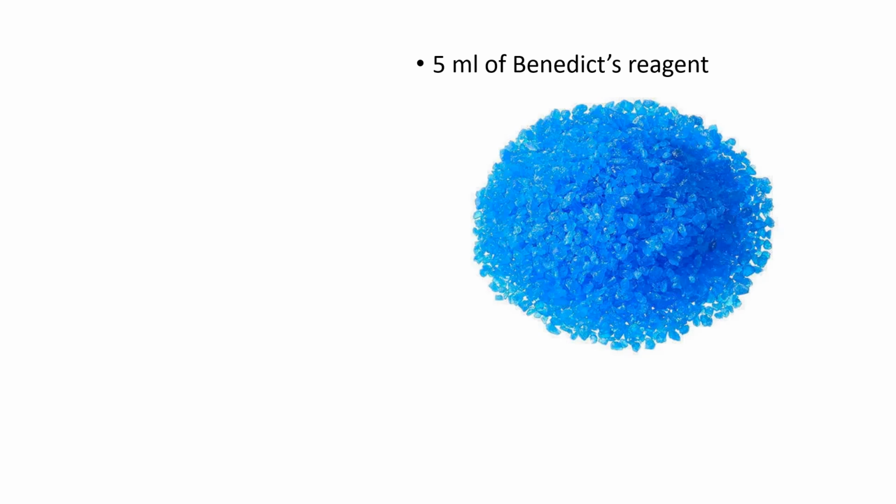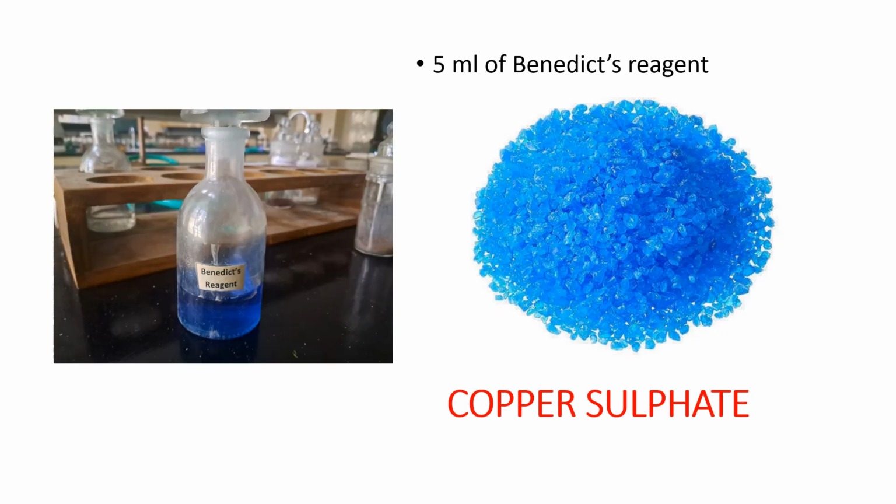It contains something called copper sulfate. So what we have is we take these very beautiful blue looking crystals and we put them into the water, and eventually we get something called the Benedict's reagent, which is an aqueous solution of copper sulfate crystals.